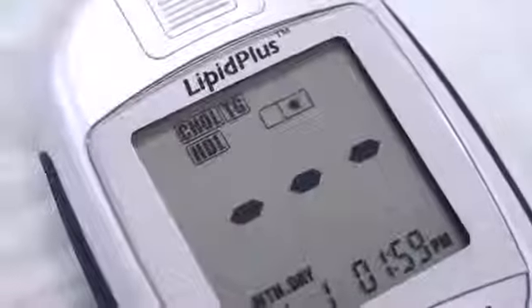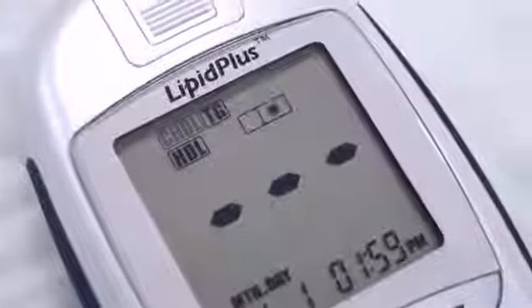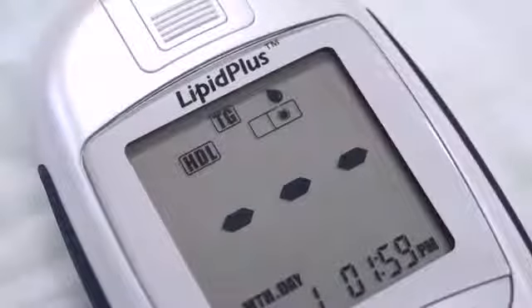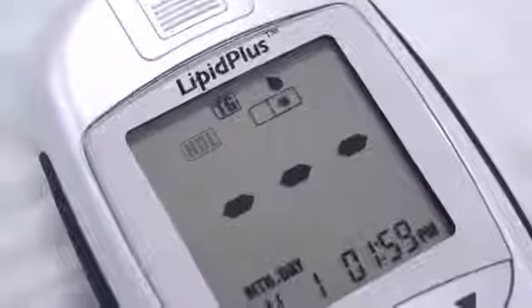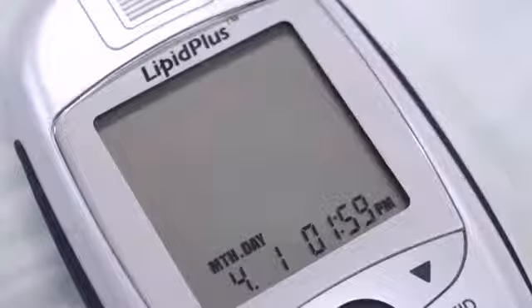After applying the blood samples, a beep should sound after each sample is absorbed. After the first beep, the cholesterol symbol will disappear. After the second beep, the HDL symbol will disappear. After the third beep, the triglyceride symbol will disappear. Once the symbols for cholesterol, HDL, and triglycerides have disappeared from the screen, a series of dashes are displayed.